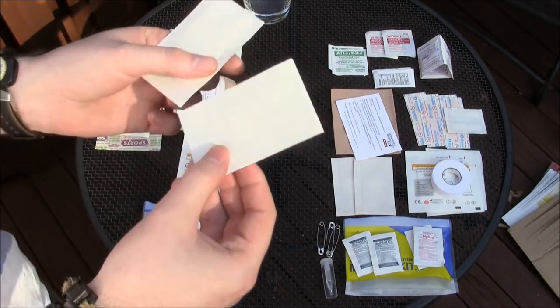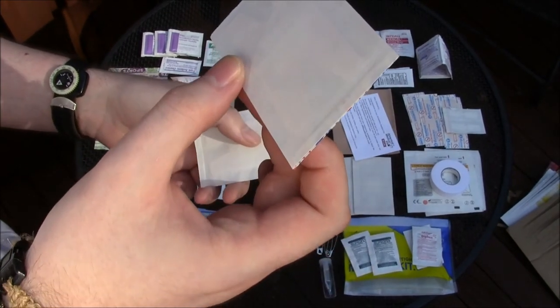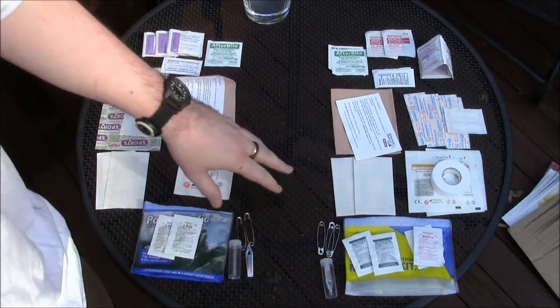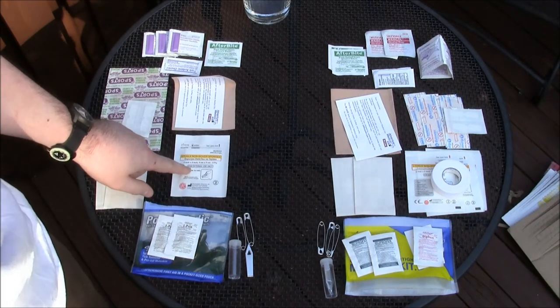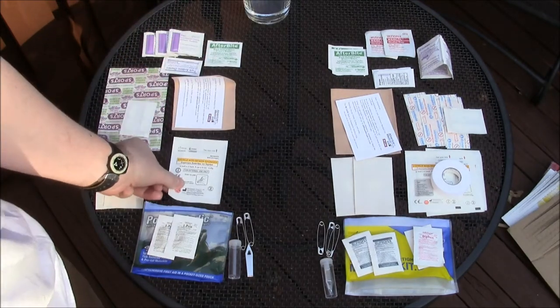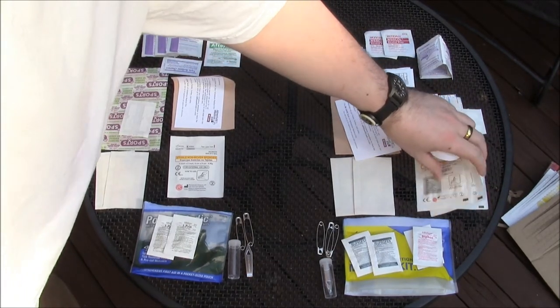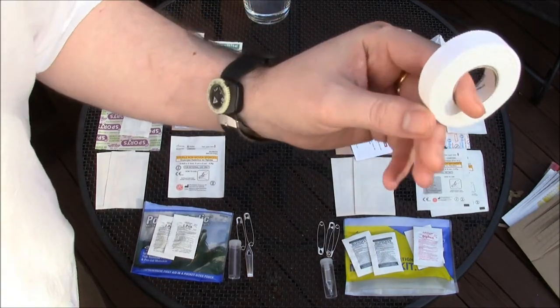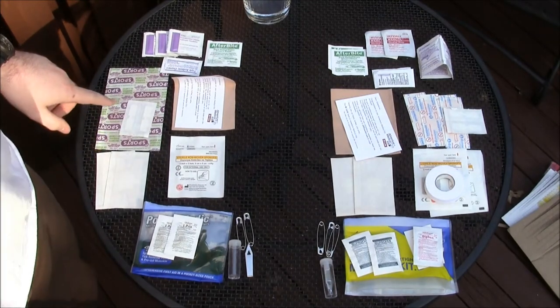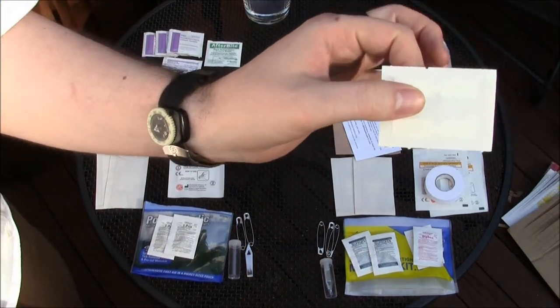They each have two figure-eight shaped bandages — I've never actually used these before, I think they're for knuckles or between the fingers. The Pocket Medic has one small piece of sterile gauze, two by two inches. The 0.3 has two or three pieces of sterile gauze the same size and also a roll of fabric tape. They each have about four standard band-aids and a couple of butterfly closures — those things are great.